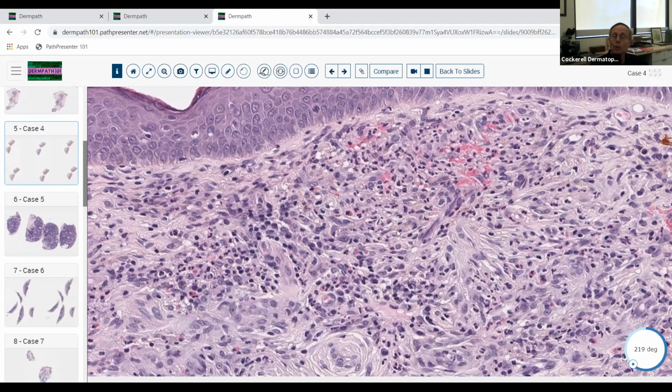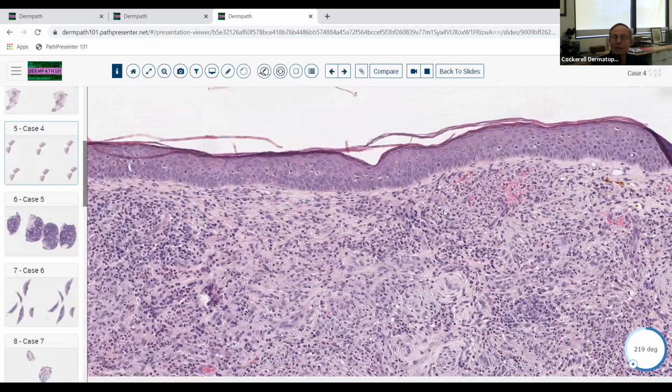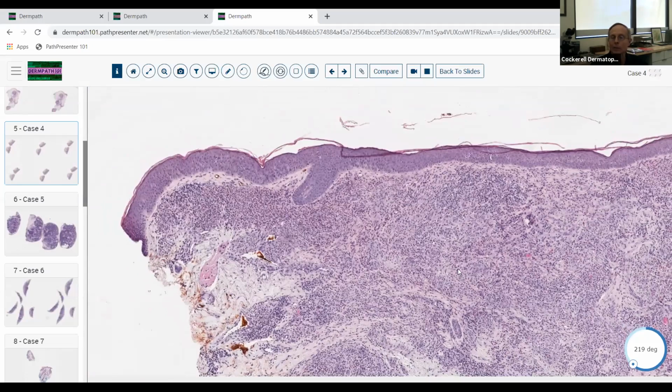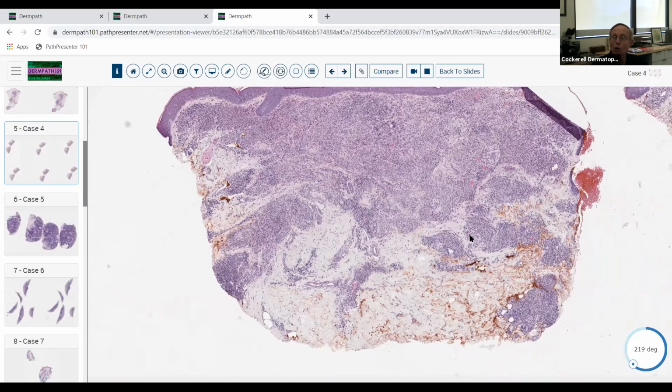But they might put on the list a pseudolymphoma, lymphocytoma cutis, which hopefully you would not choose in this setting because that does not have neutrophils, does not have any form of chronic vasculitis. That's basically a nodular infiltrate with lymphocytes and eosinophils and germinal centers. So that would not be a good choice here. It's not a classic example of just garden variety leukocytoclastic vasculitis either, because that doesn't give you this dense nodular infiltrate like we see here, even though this is considered to be a form of long-standing chronic vasculitis.